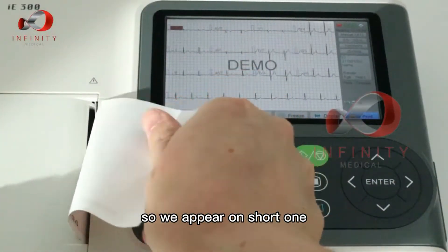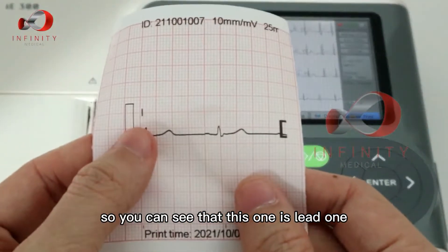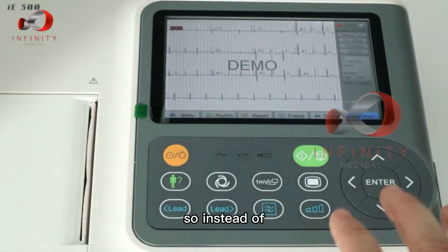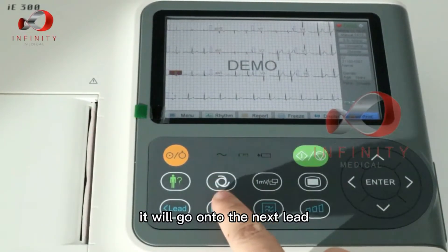In the 12 times one setting, there's only one lead which will appear. You can see this one is lead one because I have selected lead one. If you want to choose lead two or lead three instead, just press here and it will go on to the next lead.